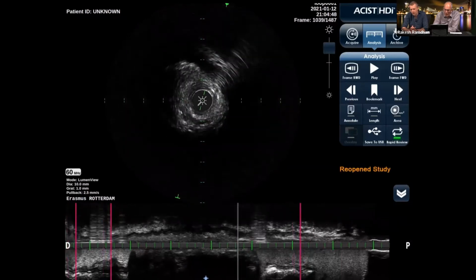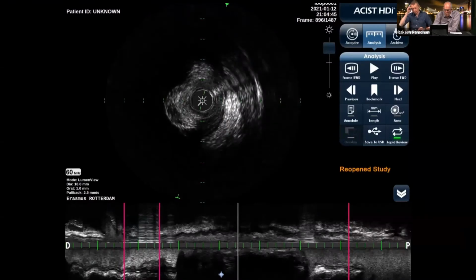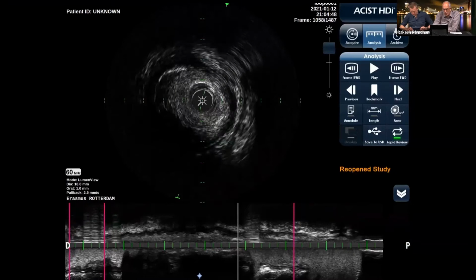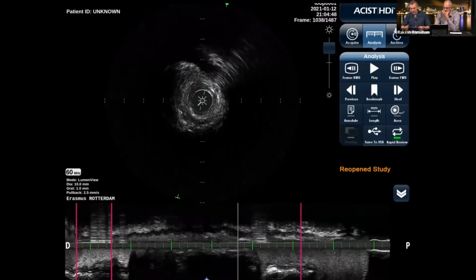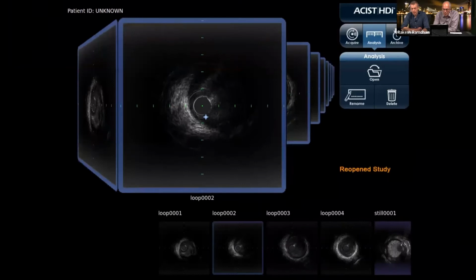It's just the fact that the catheter is occlusive and surrounded by loose tissue that is comprising the artery. That said, we continued here with aspiration thrombectomy, and then we repeated the IVUS.